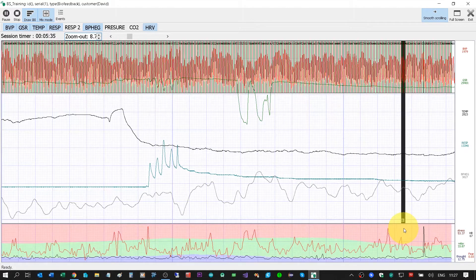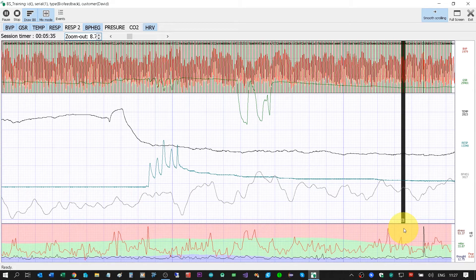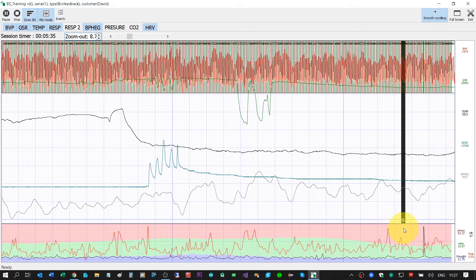In the main reading application, I can click on any button to see different sensors: blood volume pulse, GSR, temperature, respiration, blood pressure, and HRV. When I click Stop, it means I have finished my training.